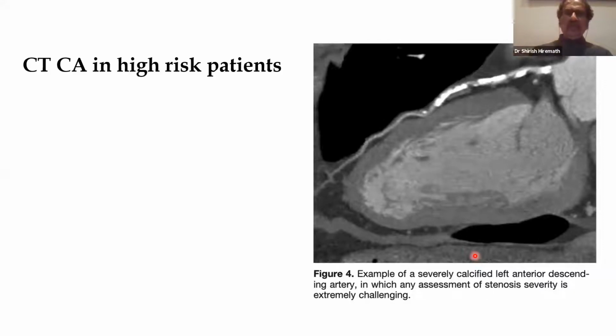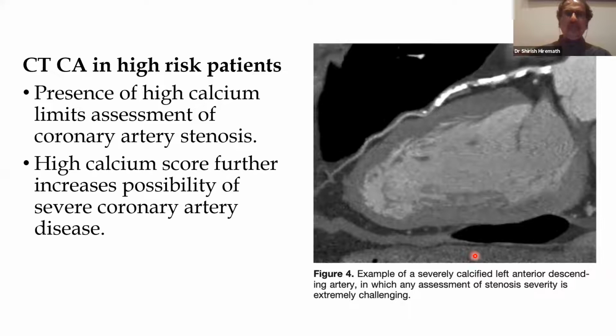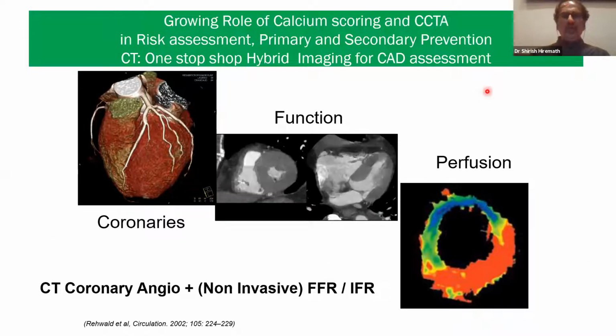When we talk of calcification, I think CT coronary angio is quite important. These days, many patients come to us before we do a catheter angiogram with a CT, and it's always good to look at the CT angiogram because it shows the calcium very, very well. You can differentiate whether the calcium is on the adventitial side or on the inner side along the lumen of the vessel by taking a cross-section view at this site, and thus prepare yourself mentally as to what you're looking for.